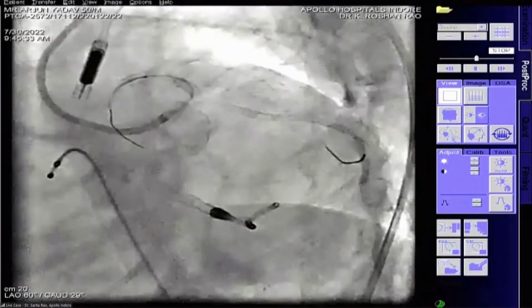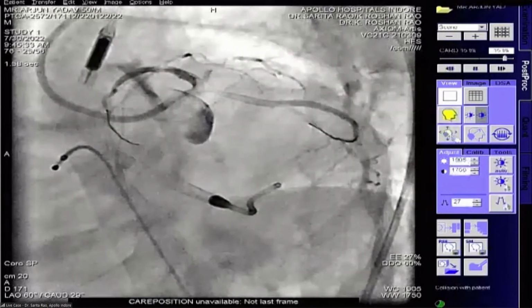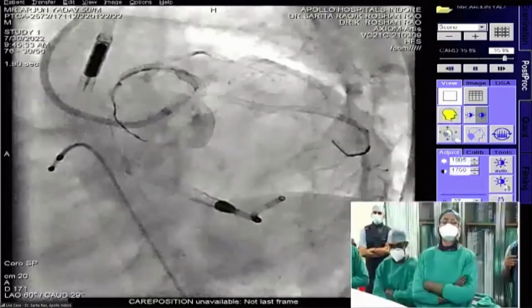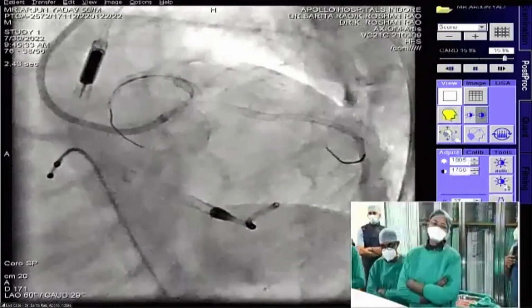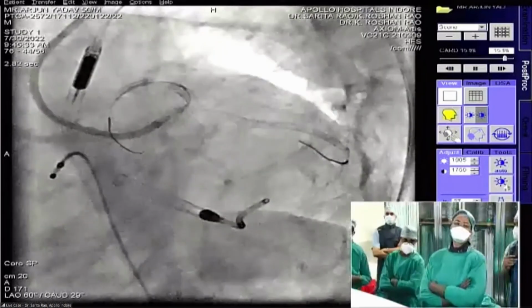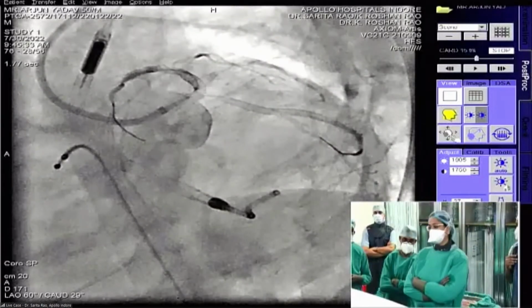That looks better. It looks better compared to the previous angiogram. Great demonstration, madam. Congratulations. I think you'll also check finally an OCT run also. And words of applause you can hear from all of us. Great demonstration of an Impella-supported severe LV dysfunction patient post-infarct, and with all care. And that demonstrates how good the PCI techniques are.